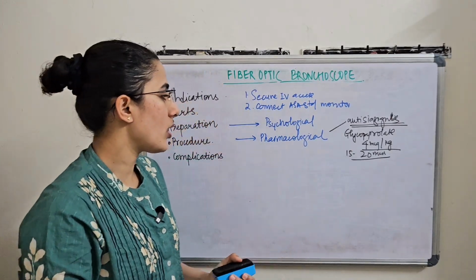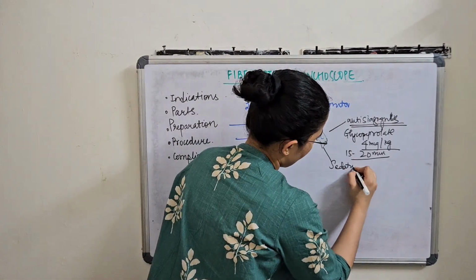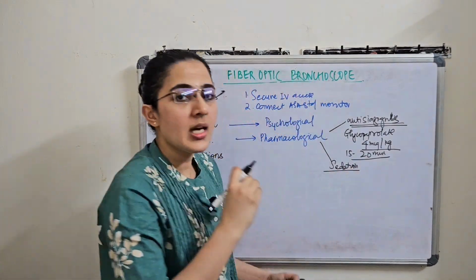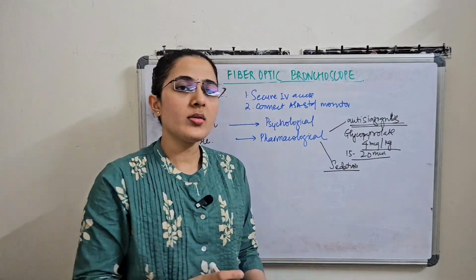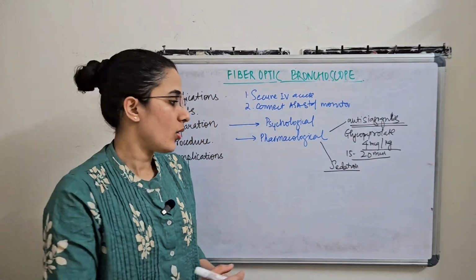The second pharmacological preparation is the sedation which we offer to the patient in order to alleviate the anxiety of the patient. Most commonly we can use midazolam 1 to 2 milligram.